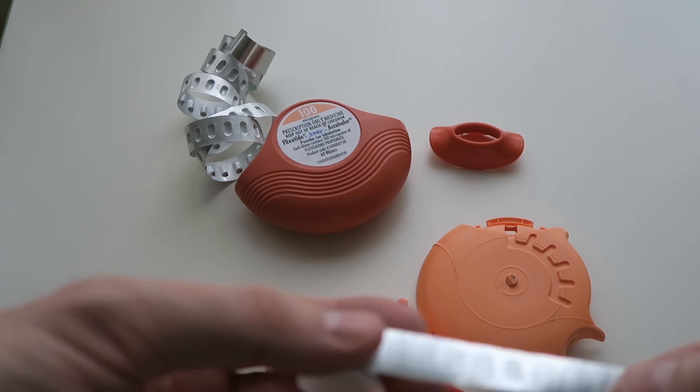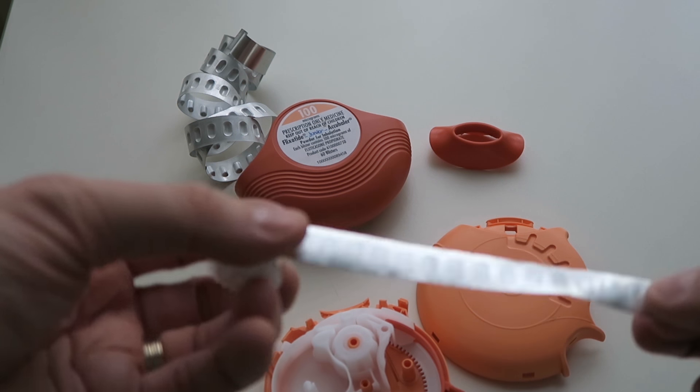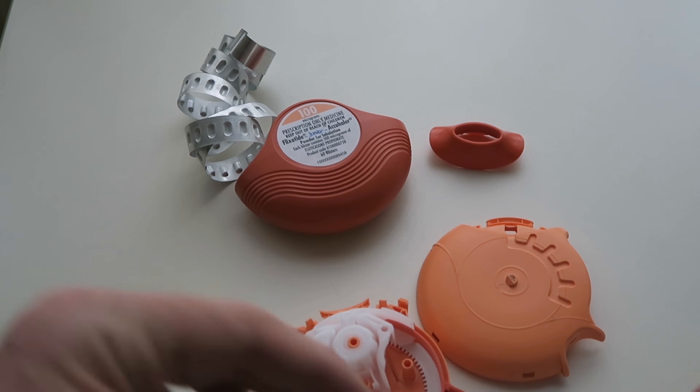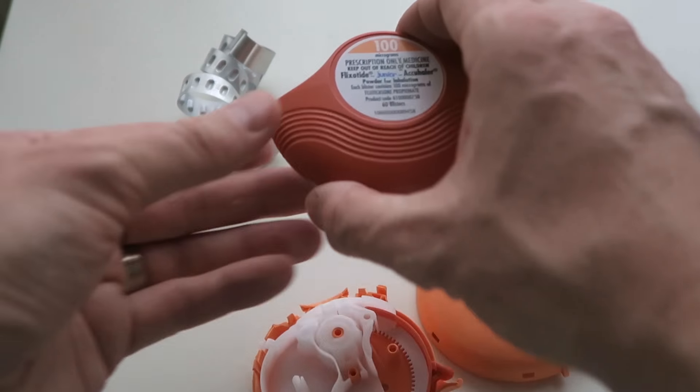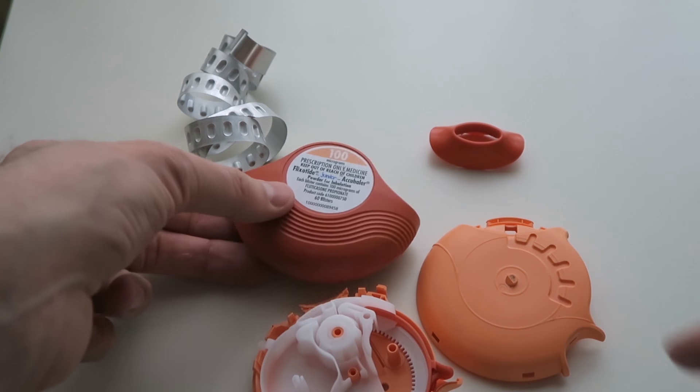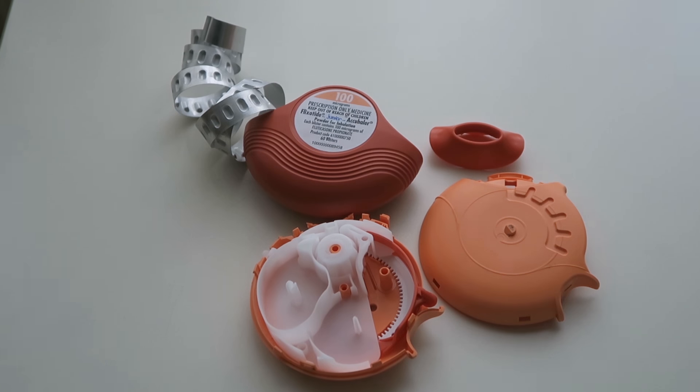So yeah, you can see just little powder residue on the flat bit that would have sealed it up. So there you have it, insides of an AccuHaler delivery device.